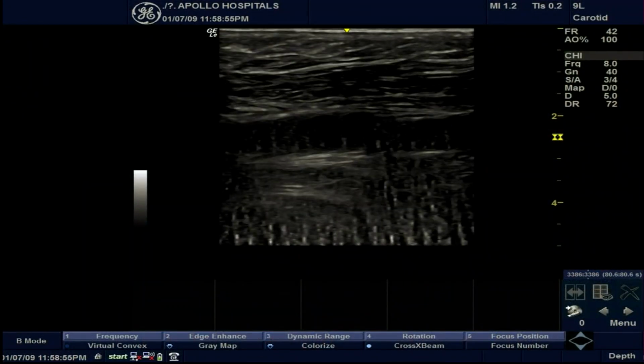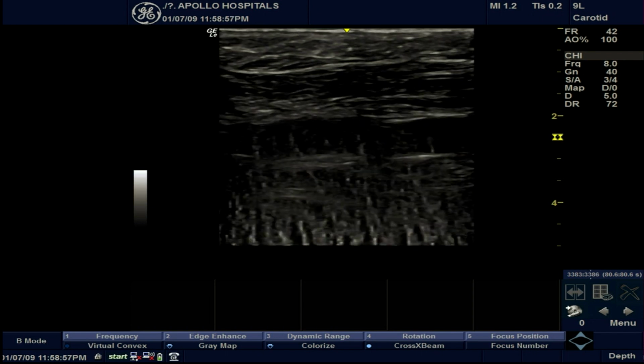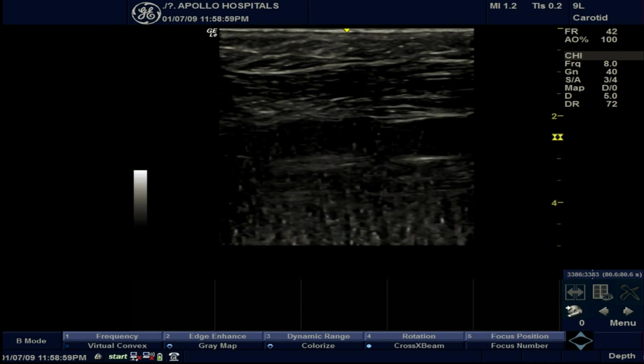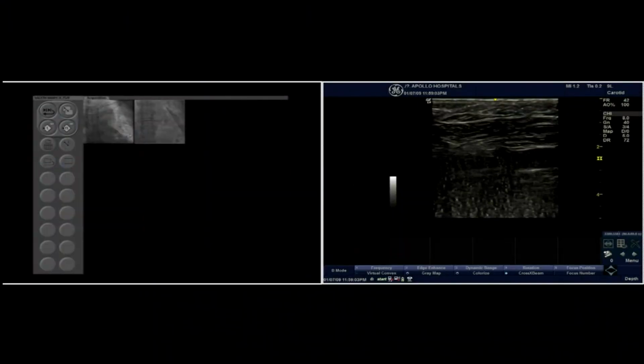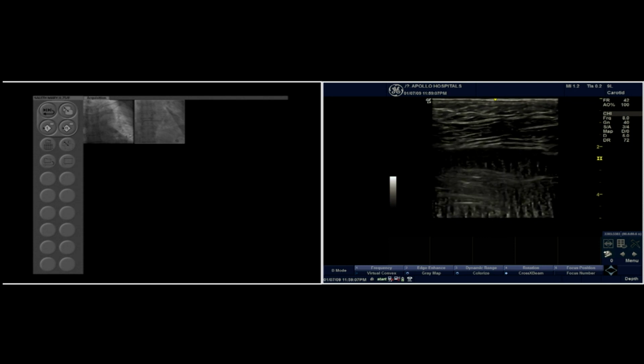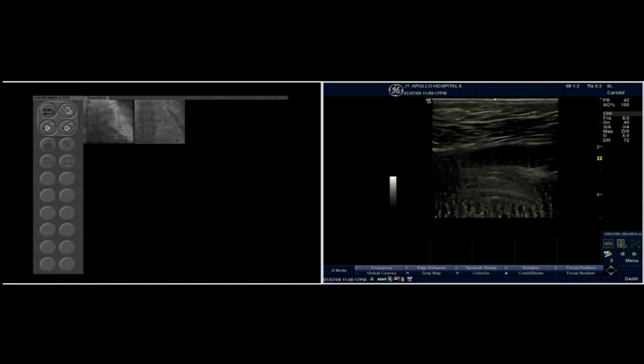So our plan is to use ultrasound guided puncture, and we want to use 2 ProGlides, and then go with the Confida wire across the aortic valve, use an 18 millimeter balloon to predilate, and then use a 23 millimeter MyValve. So that is the plan. So let's start with the ultrasound guided puncture.